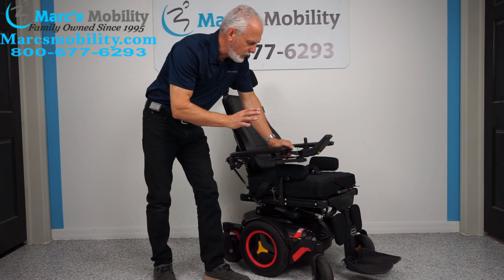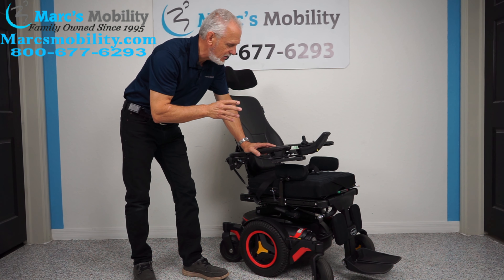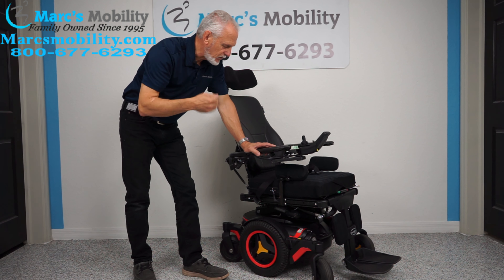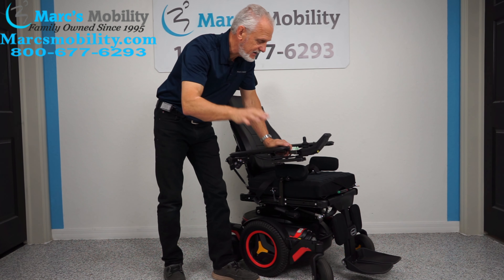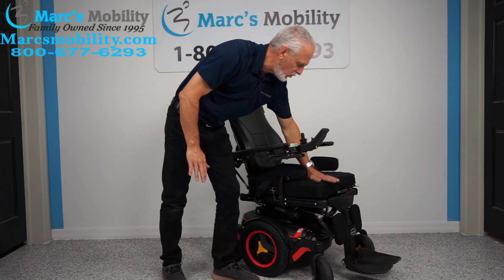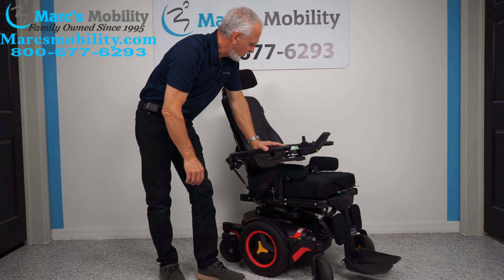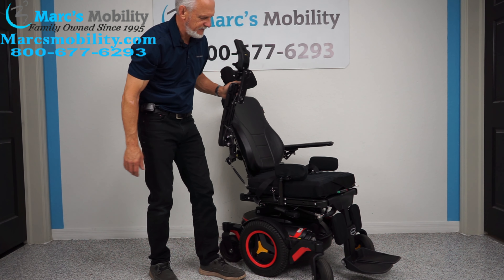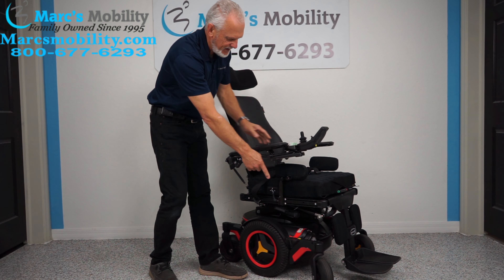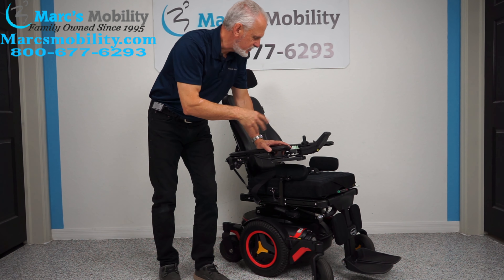Let's recap: this is a Permobil M3 mid-wheel power chair with 118 miles — used about five months, still in new condition. It has the 12-inch seat lift, electric tilt, electric recline, and electric feet. The seat cannot go lower than 24 inches, so you're always starting high. It also has a swing-away joystick, flip-up arms, safety belt, a Roho air cushion — which is a very expensive air cushion — lateral pads, anchor points, and an adjustable headrest. A high-quality power chair ready to go.